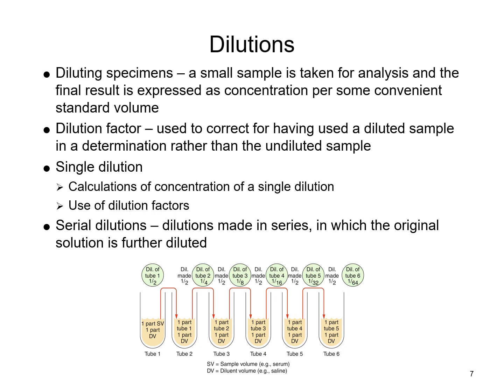If we move half of that over to the next tube that already has diluent and mix, it halves the solution even more. Then you just keep going. Basically, serial dilutions set you up for the ability to perform titers, antibody titers.